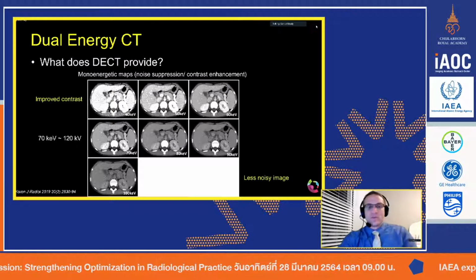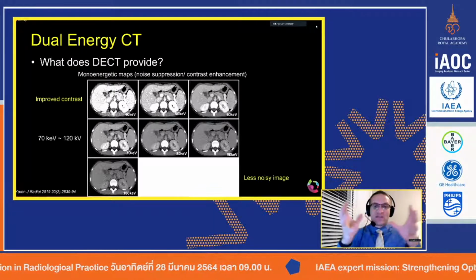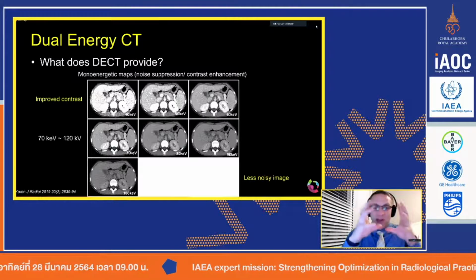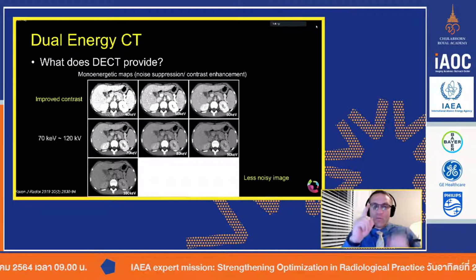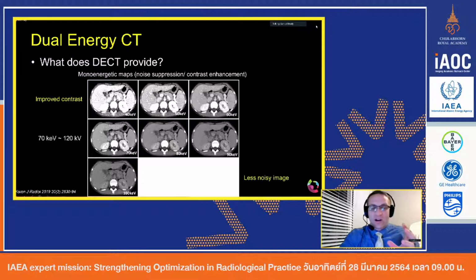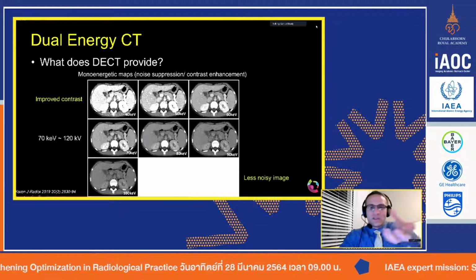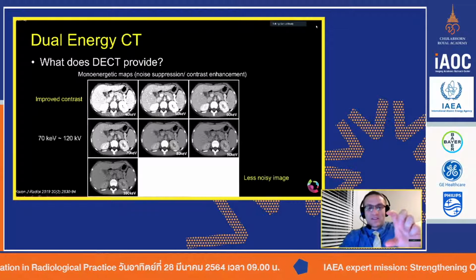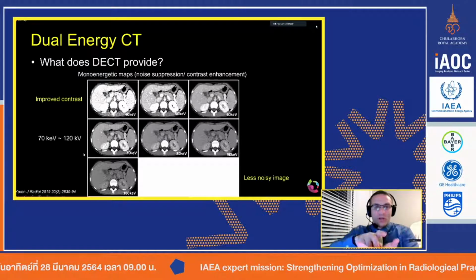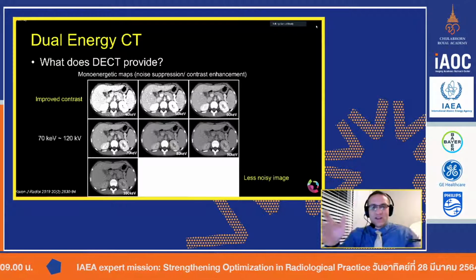The main reason I would use dual energy in kids is that you can get five or six or seven different views or looks, different ways to look at that child's image, for the price of just one image. If you're trying to look at a high contrast image, but you think it's too noisy, you can simply dial it back and look at a less noisy image, or keep dialing it. Instead of, you can window and level using your mouse, right? You can window and level, it goes gray, and it changes the grayscale.